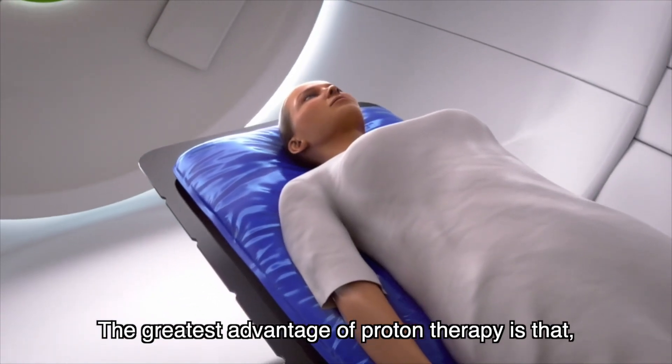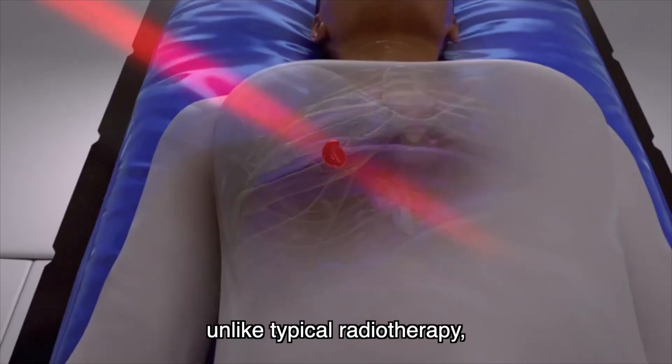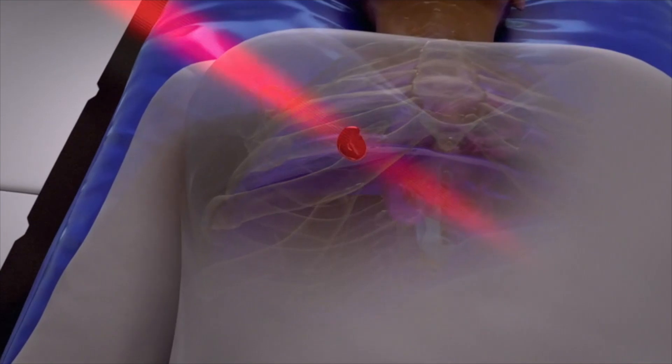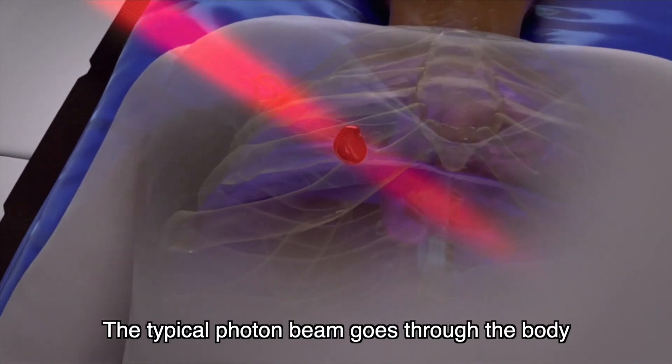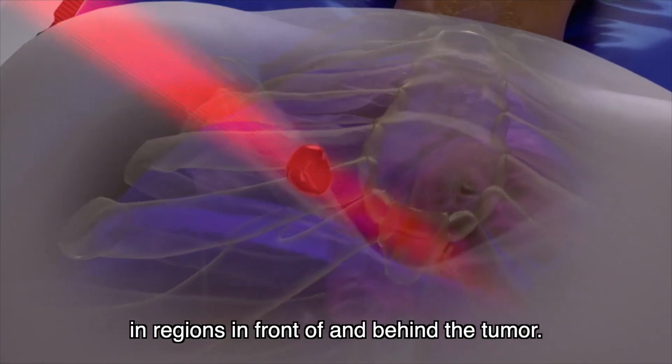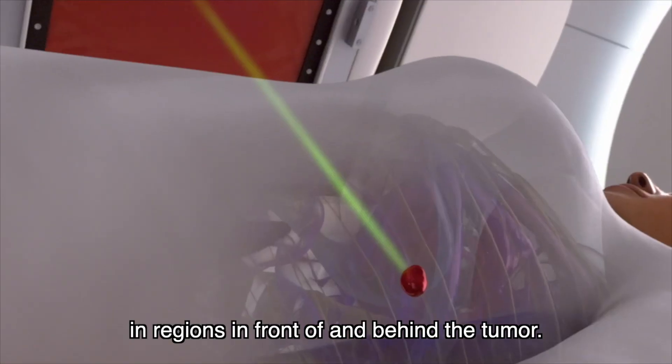The greatest advantage of proton therapy is that, unlike typical radiotherapy, it is precise and able to protect healthy tissues. The typical photon beam goes through the body and emits a significant portion of its energy in regions in front of and behind the tumor.